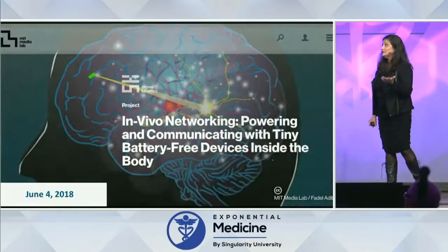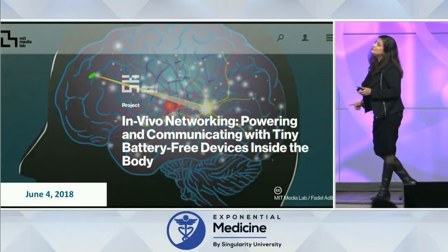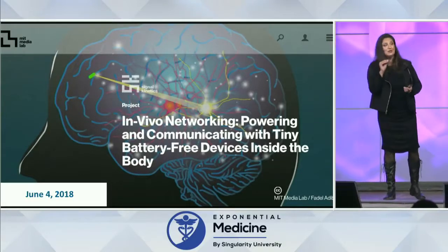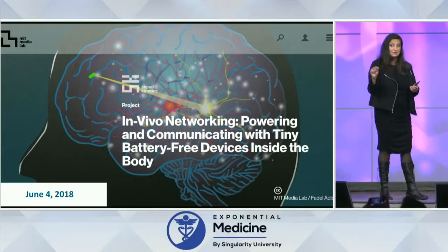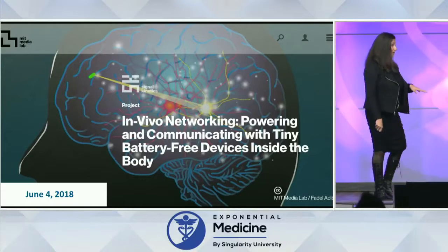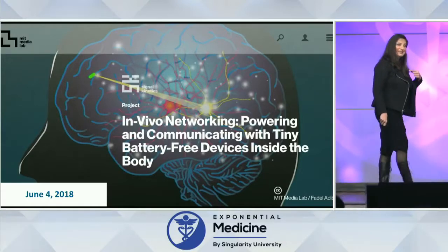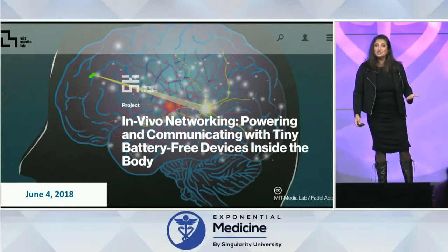So this is an interesting concept. This also just came out recently this summer from the MIT Media Lab. They were able to develop a series of small devices that no longer need any sort of power or battery control. They're controlled by radio waves. So you can now modulate the inside of the brain from the outside using radio energy.